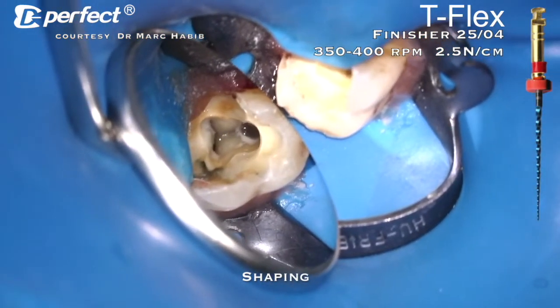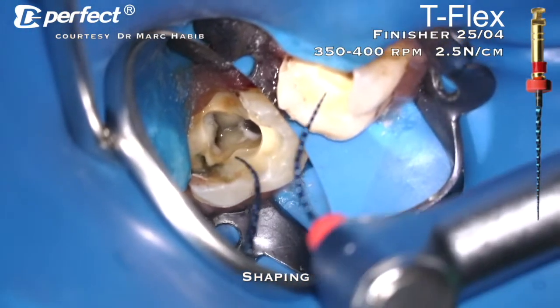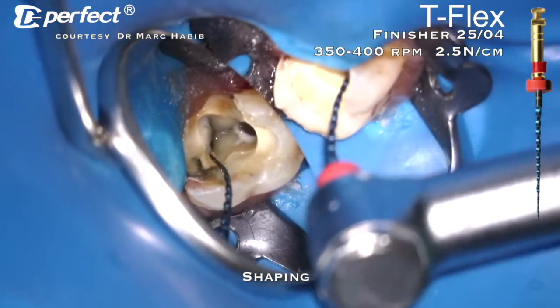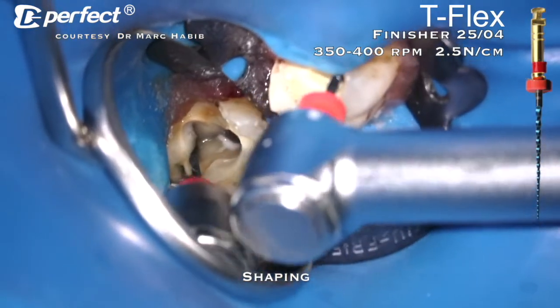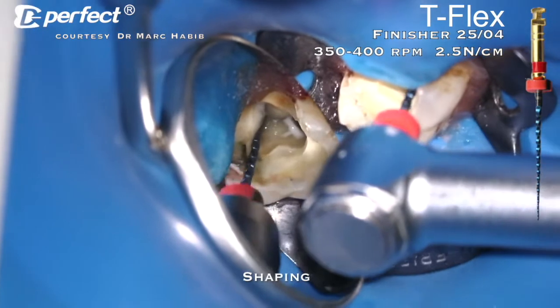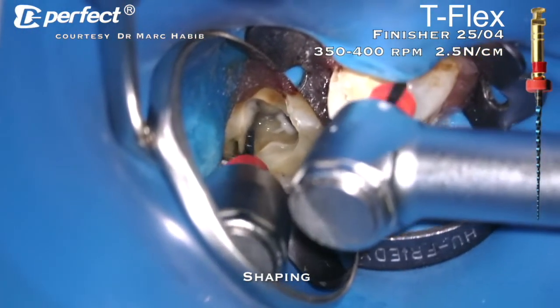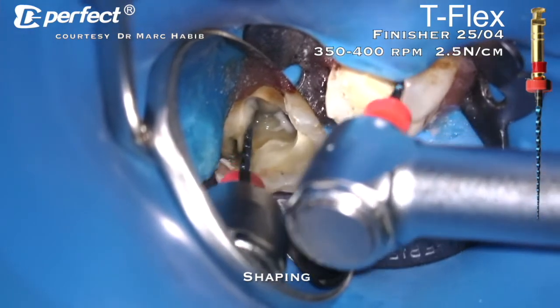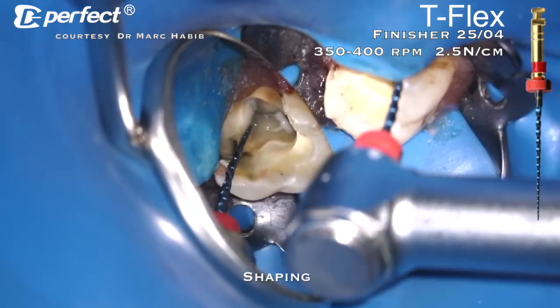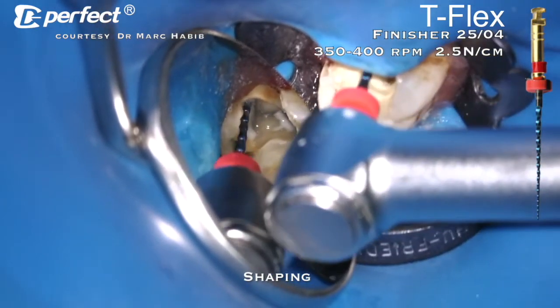So on this part we are preparing the apical third of the root. For the mesial canals we are pre-bending it and trying to reach it under indirect vision with the mirror and prepare the mesiobuccal canal. We go ahead and do the mesiolingual canal as well.